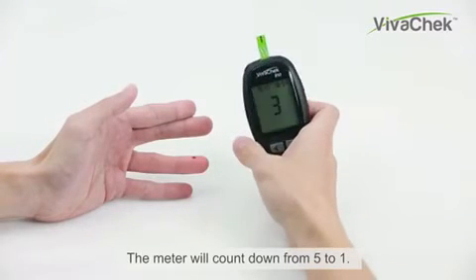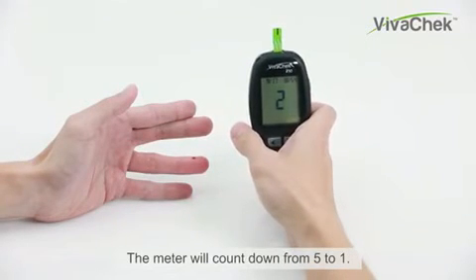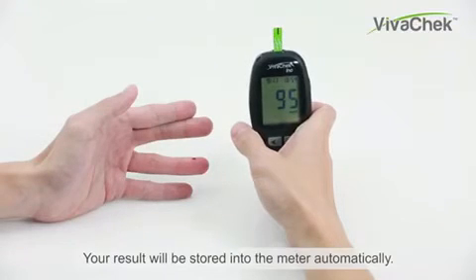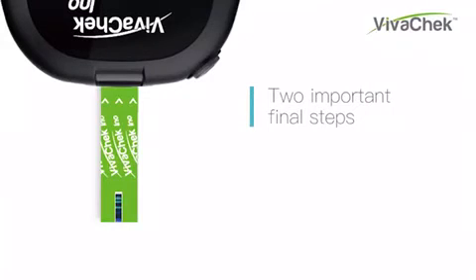The meter will count down from 5 to 1. Now you have your test result on screen. Your result will be stored into the meter automatically. Two important final steps follow.